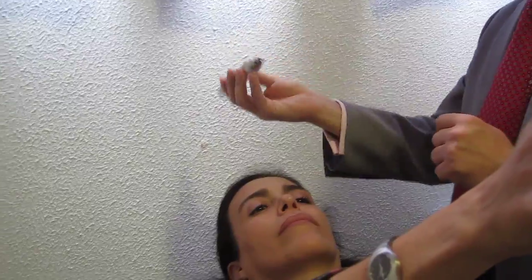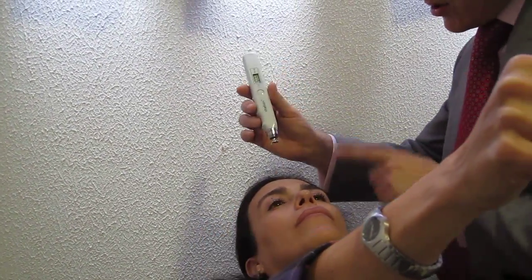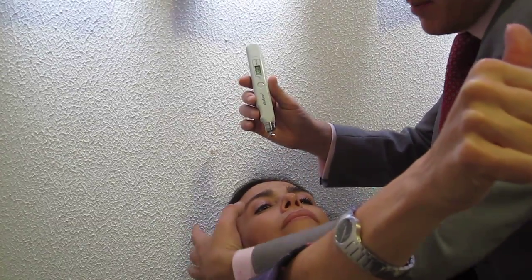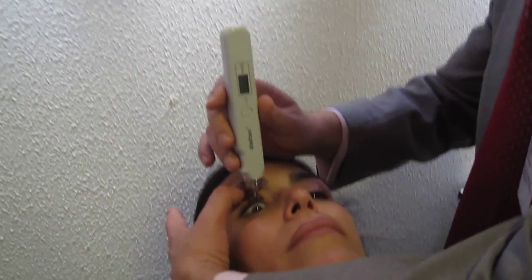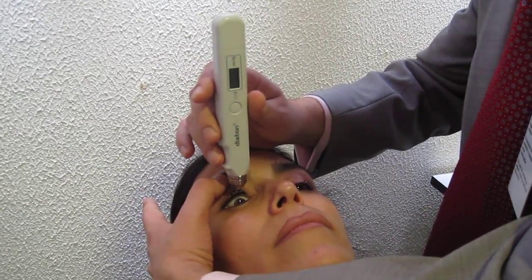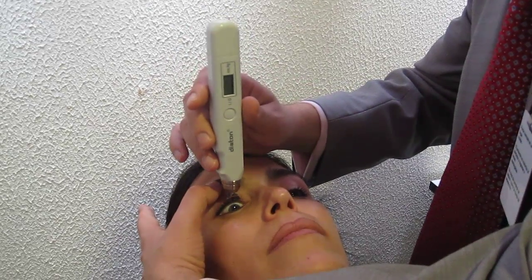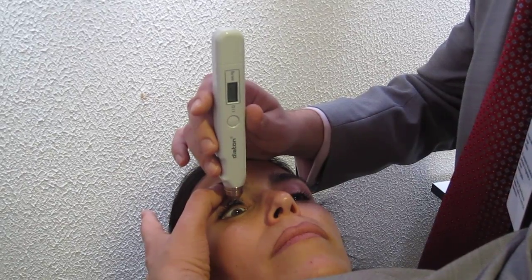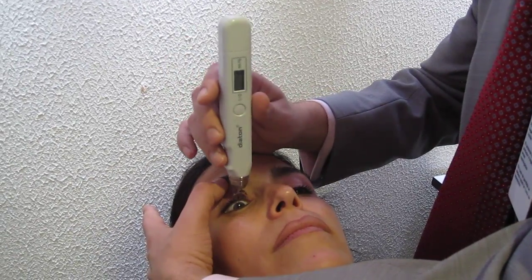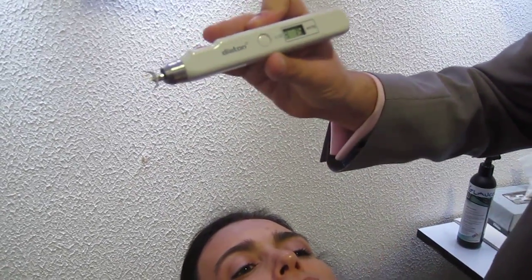For the second eye, you're still on the same side of the patient. Make sure the patient is looking at the finger — here I use the index finger. Use the thumb to make sure the edge of the lid is above the edge of the limbus. You want to make sure the eyelid is above the cornea to make the reading — we want to avoid the eyelid sliding onto the cornea. One, two, three. The device gives you a long beep. Press the center button and you get the reading. We got 15, 16.